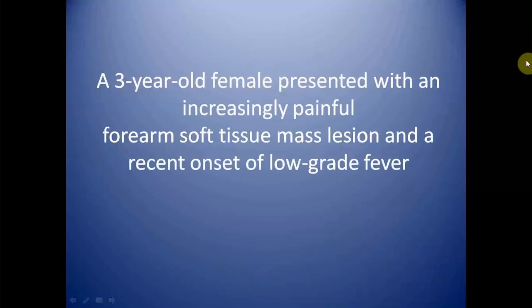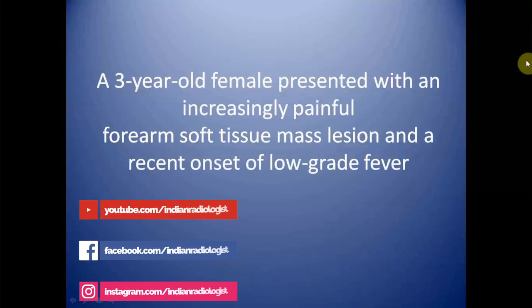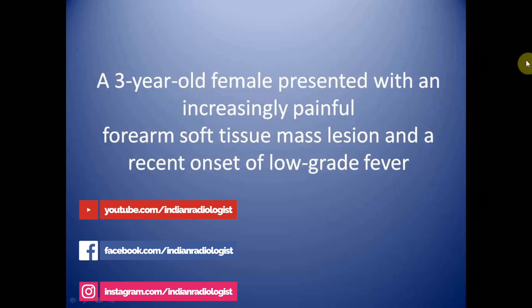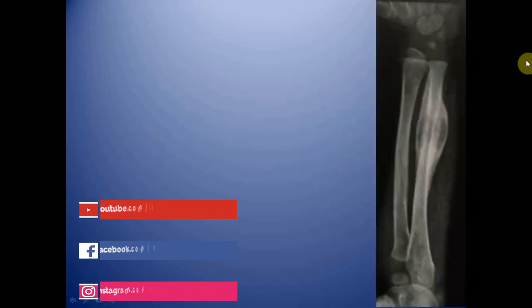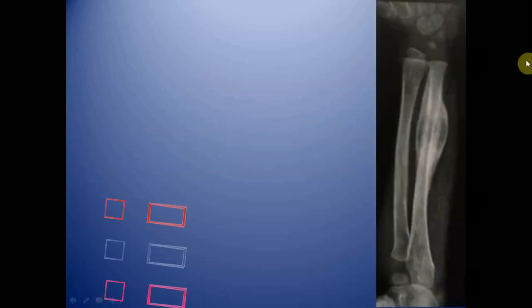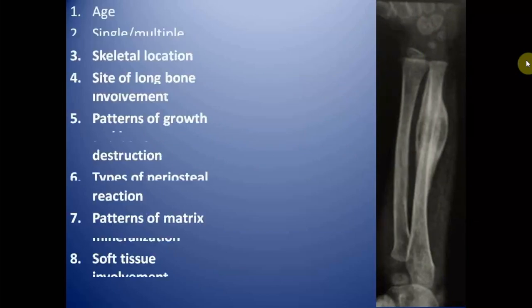This is the case of a 3-year-old female who presented with an increasingly painful forearm soft tissue mass lesion and recent onset of low-grade fever. This is the frontal radiograph of the forearm of the patient and we will review this lesion on the basis of the following criteria.